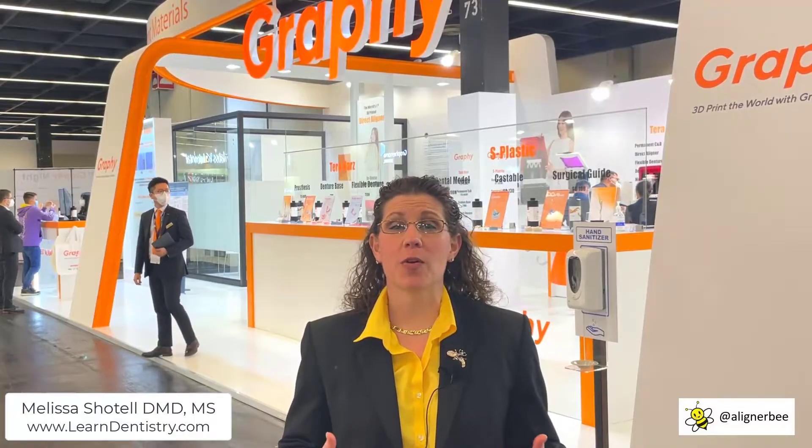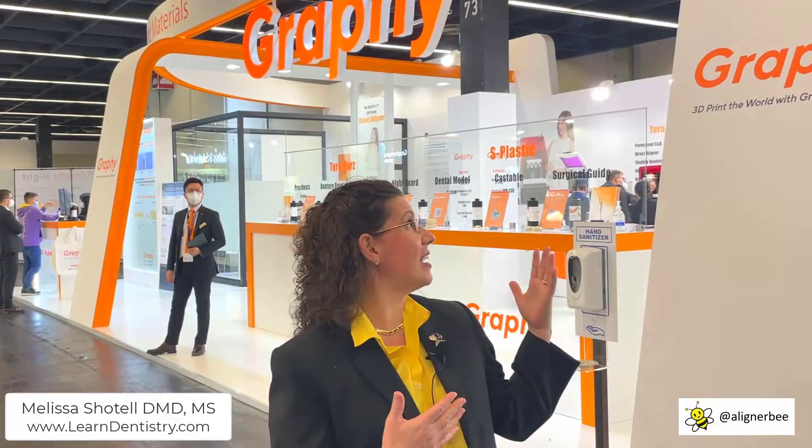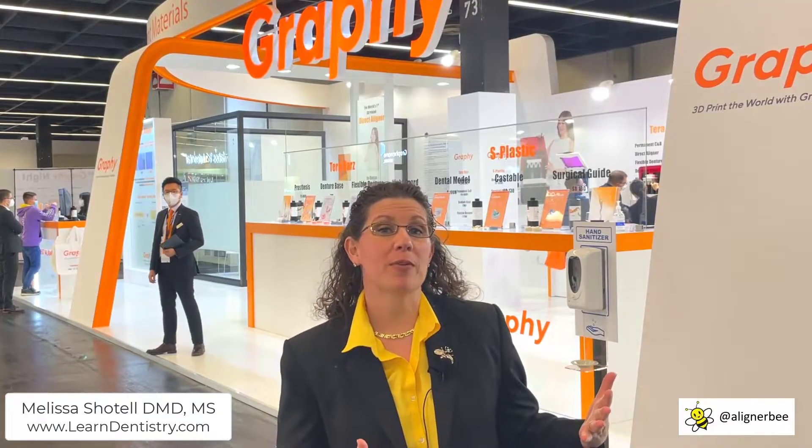Hi, this is Dr. Melissa Shotell, also known as the Aligner Bee, and I'm here at IDS in Cologne, Germany. I've been working around, checking out all of the new technology and innovations for orthodontics and clear aligner treatment, and I found my way here to the Graphy booth.